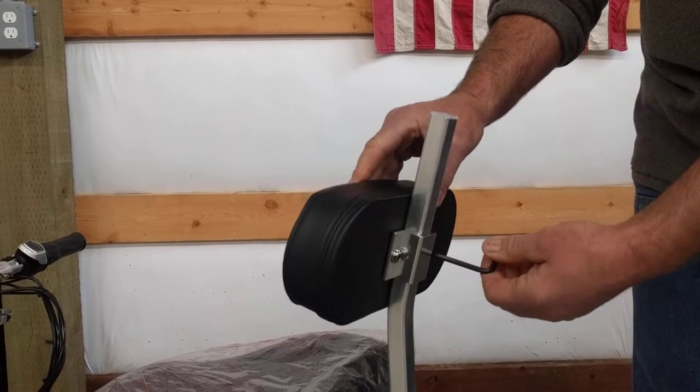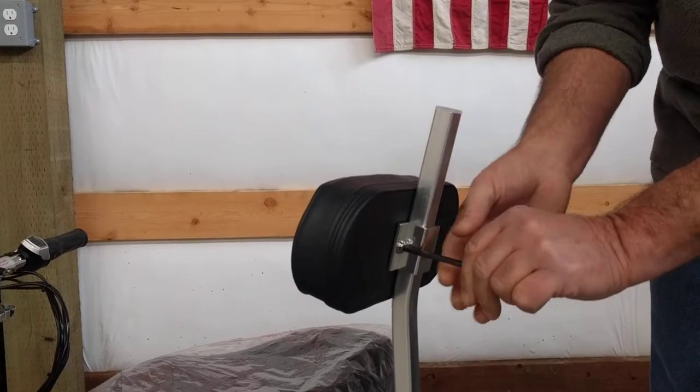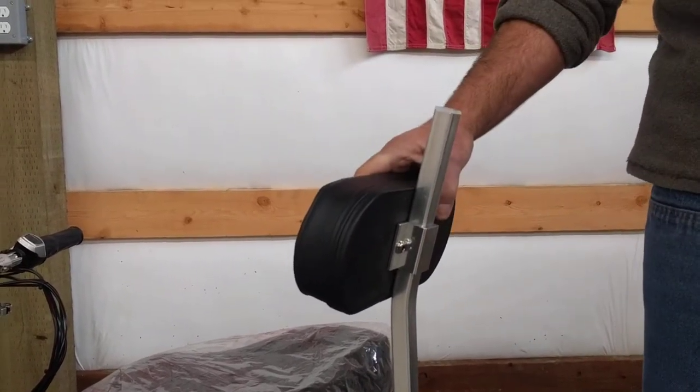Be it your lumbar region, the middle of your back, whatever works for you — tighten the bolts, and off you go.